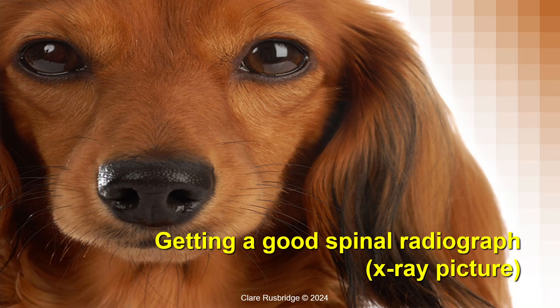If a dog or cat is suspected to have a spinal cord problem, many vets will recommend getting spinal x-rays as the first step in the diagnostic investigation. However, getting a good spinal radiograph is a lot more challenging than people think. I get sent an awful lot of non-diagnostic images, which were a complete waste of the animal having an anesthetic and a waste of money for the client. So in this video, I'm going to impart my tips for getting the best imaging that you can.